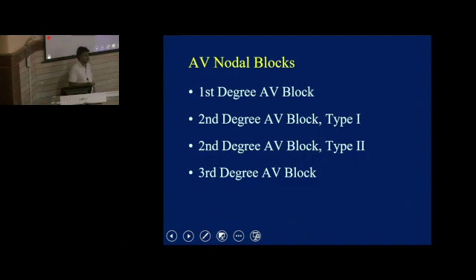So till now, what abnormal ECGs did we see? SA nodal block, where there will be no cardiac cycle at all, right? And then we saw sinus bradycardia, sinus tachycardia, and junctional rhythm, where we don't have any P wave, okay, the rhythm is generated from the junction, just a QRS complex, maybe followed by some abnormal P wave. And what else did we see? Premature atrial contraction and premature ventricular contraction, right? So these are the things we saw till now.